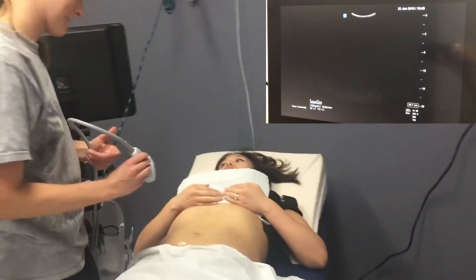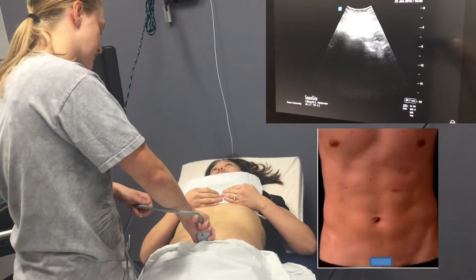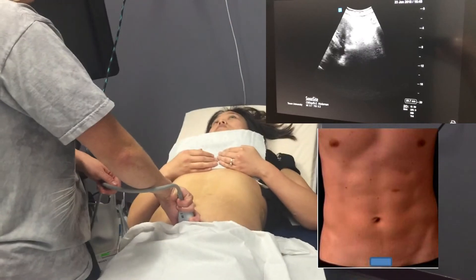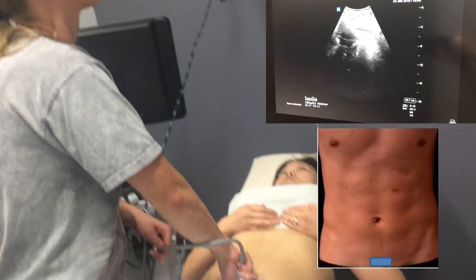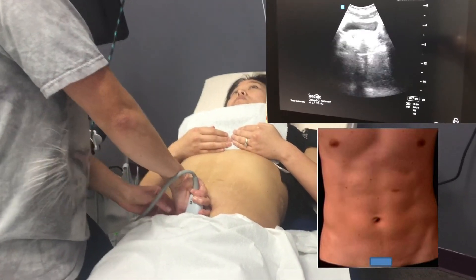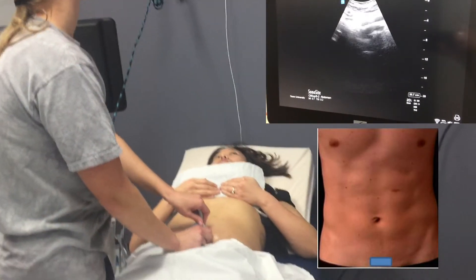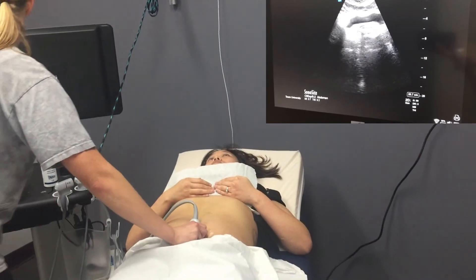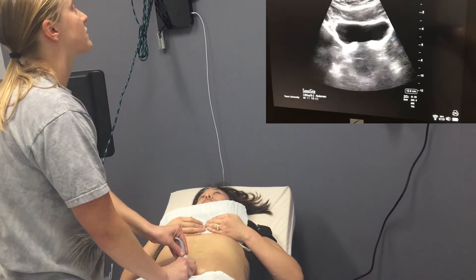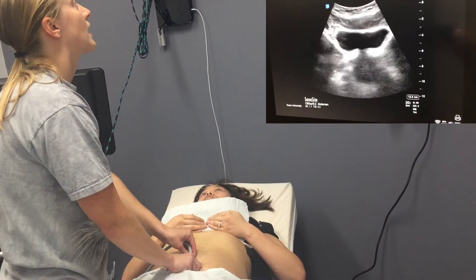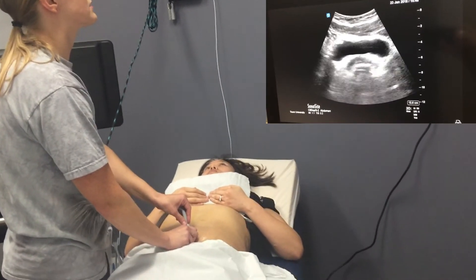We'll move on to the pelvis. I'll point the indicator to the patient's right and move inferiorly until I hit the pubic bone, then fan inferiorly until the bladder comes into view — that anechoic sac there at about four centimeters. I'm going to decrease my depth and fan through in this short axis view from superior to inferior. I'm looking for free fluid between the bladder and the uterus and between the uterus and the rectum.